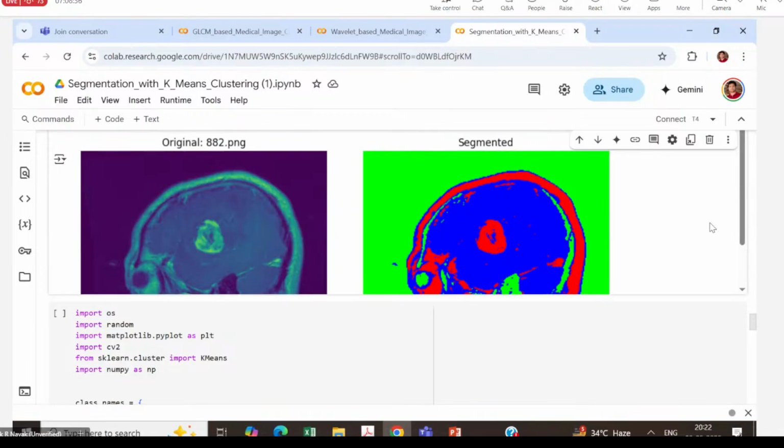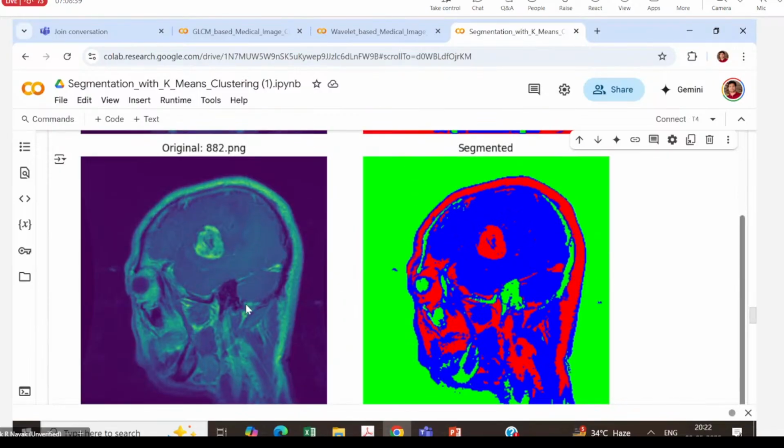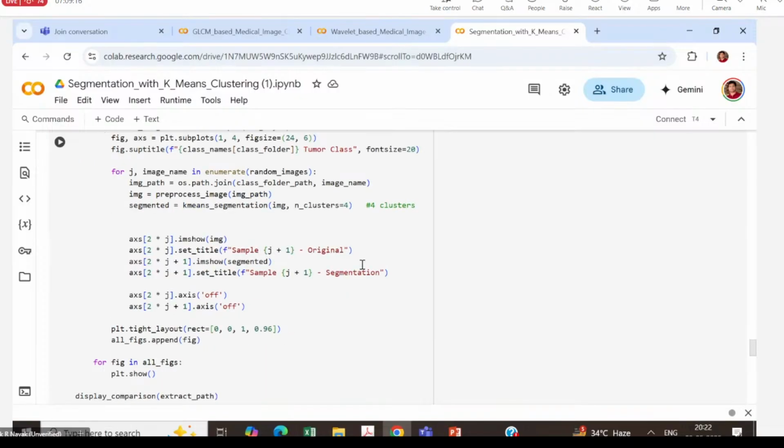And most of them are also supervised in nature. When it comes to supervised, that means you must have the input image as well as the ground truth image. So the labeling of images for a classification problem is very easy, right? The clinicians will only check the image and tell yes, it belongs to, let's say, pituitary, or it belongs to meningioma. But in case of segmentation, the doctor has to annotate pixel-wise, right? So I'll discuss later how to solve this segmentation problem with the help of convolutional neural networks, and what changes we have to make in the classification based CNN to solve the image segmentation problem. I hope you got the idea at least.